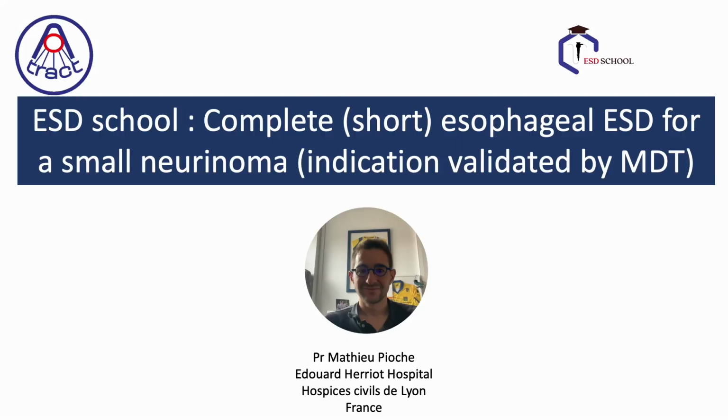Enjoy the video. Dear all, today we will see a complete but very short esophageal ESD for a small neurinoma, a nervous tumor with a pathology that left some doubt about the malignant or benign component. Finally, the cancer center close to our hospital validated an indication of ESD to be sure.